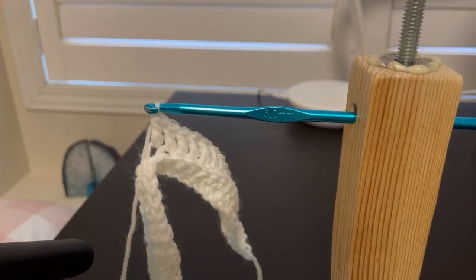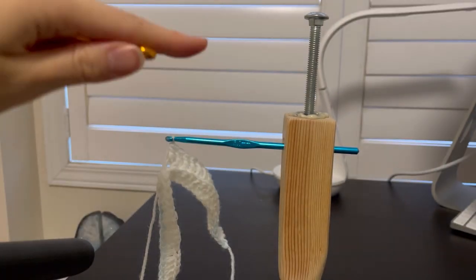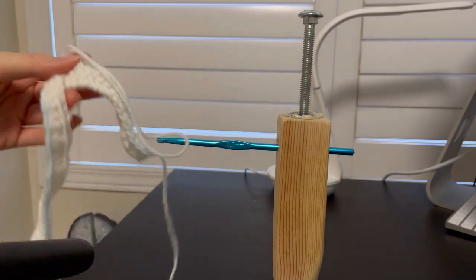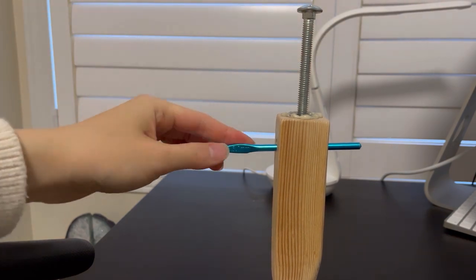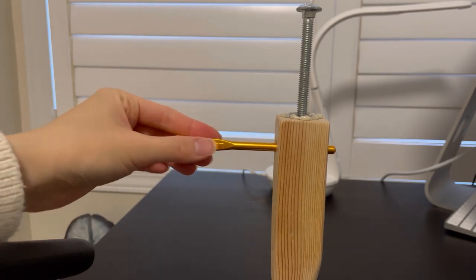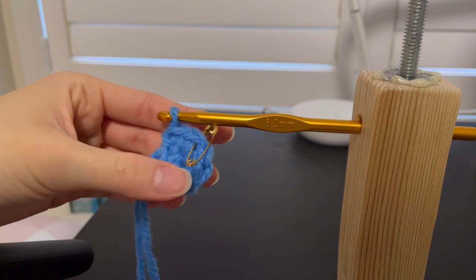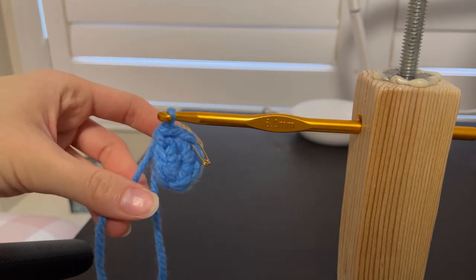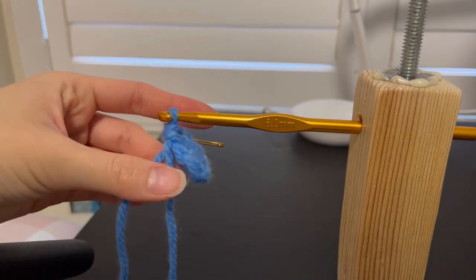Let's zoom out and change the crochet hook. We have a 6mm hook here and we're going to change the 5mm hook to the 6mm hook. First, we're going to take off this piece and put it aside, loosen the screw by turning it, then take the 5mm hook off. We're going to fit the 6mm hook into the hole and then turn the screw so that it's tight. You can do rows and rounds — anything you can do with traditional crocheting, you can do with a crochet aid similar to this one.